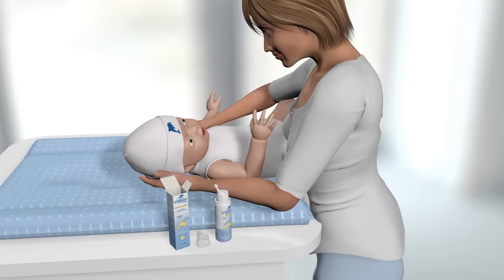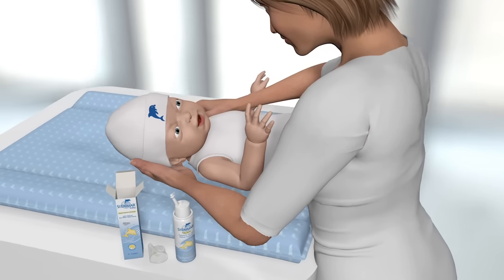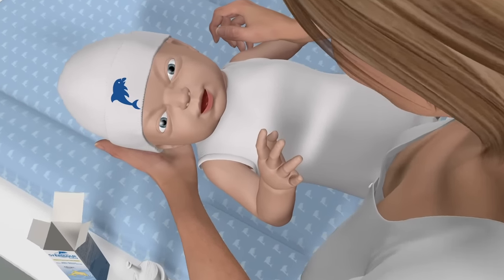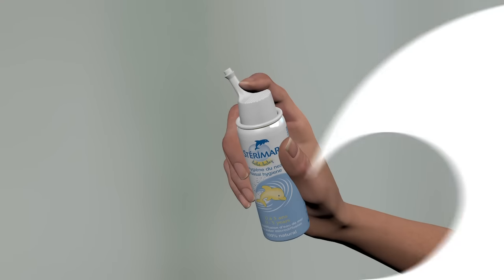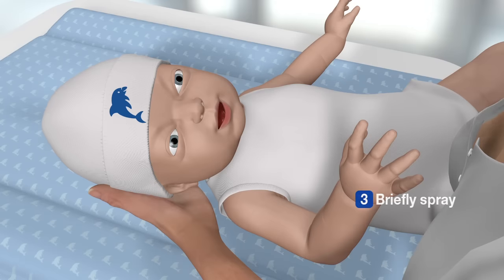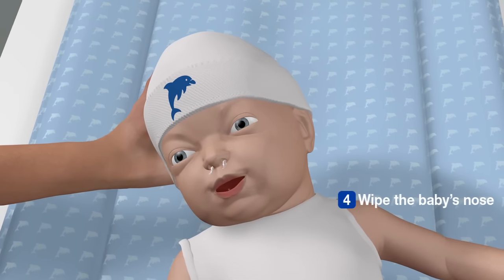In order to use Steromar on your little one, either lay them down on their side or have them sit up with their head tilted to one side. To avoid mucus going into the back of the throat, do not tilt their head backwards. Firstly, prime the spray by briefly pressing the nozzle and then gently insert into one nostril. Briefly press the nozzle to spray. Ensure that any excess solution runs out and then wipe their nose with a tissue.